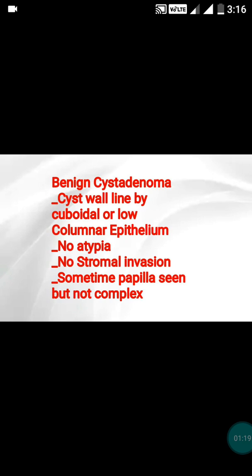You can see on this screen that the cyst wall is lined by cuboidal or low columnar epithelium — that is the characteristic feature of any serous tumor. Since it is a benign tumor, nuclear atypia is not seen, and there should also be absence of stromal invasion. Sometimes papillae might be seen, but they should not be complex — that word is important: not complex.